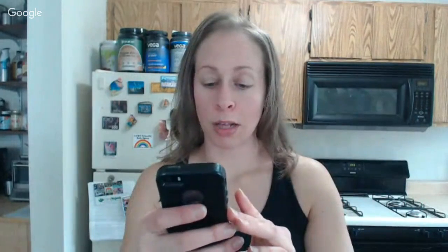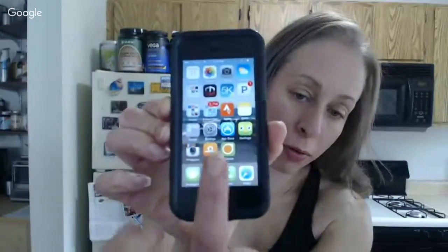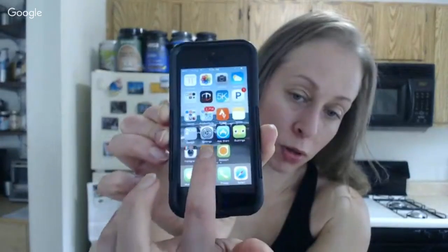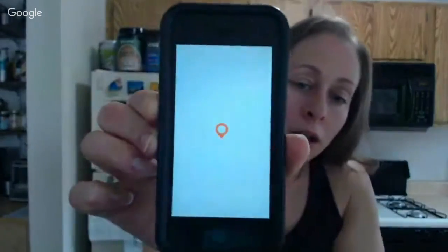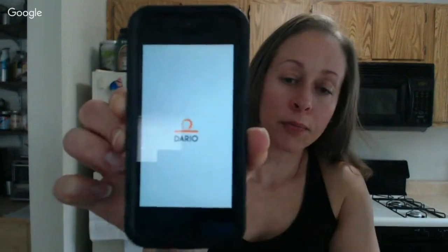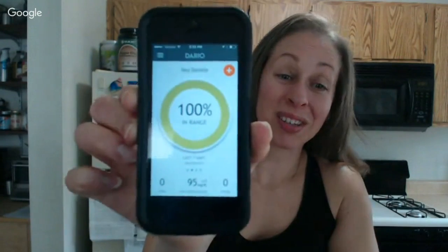So let's actually do the blood glucose test. All you need is a phone. This is an iPhone 5S. Let's go back to the main screen so I can show you exactly how it looks. So this is the main screen, and this is the Dario app right here, the orange thingy with the white symbol on it. We'll click on that, and it opens up. We'll give it a second while it loads. So it's saying I'm 100% in range because this is only reading today.